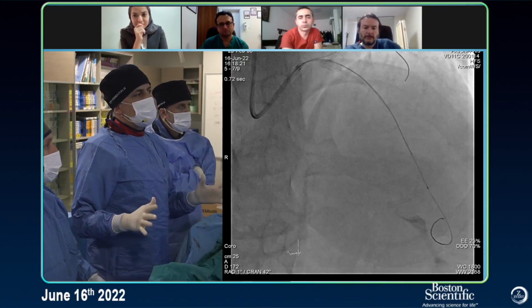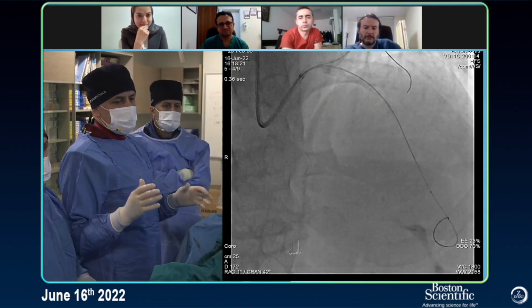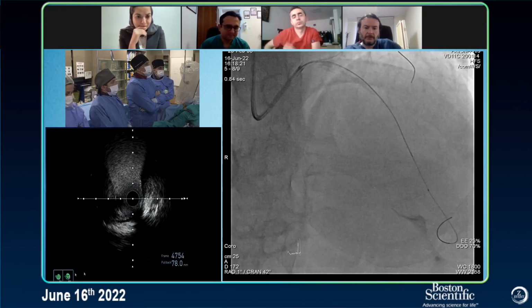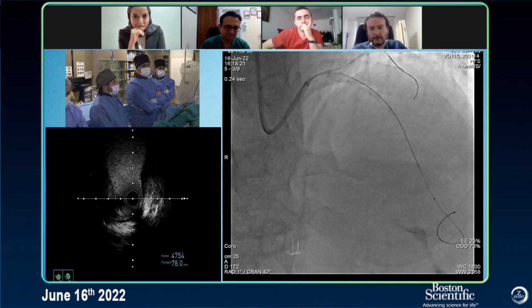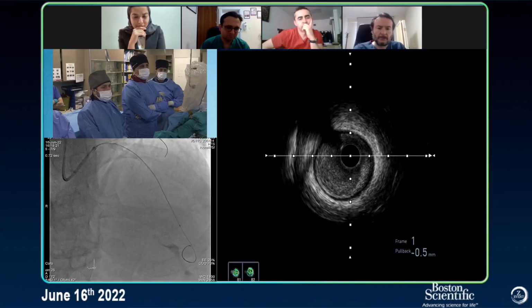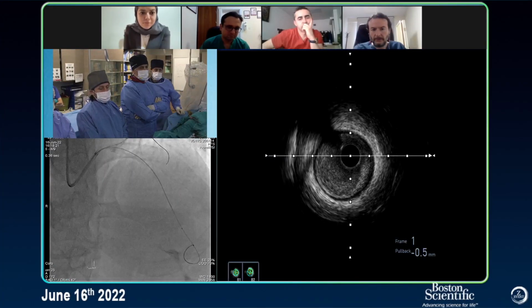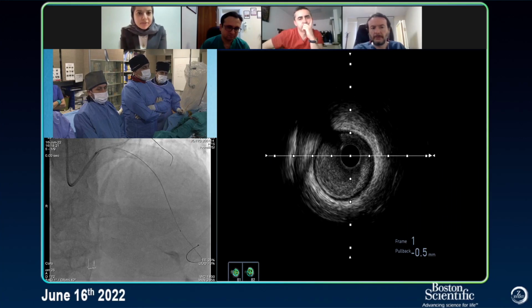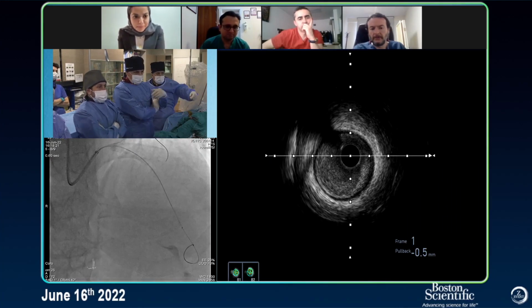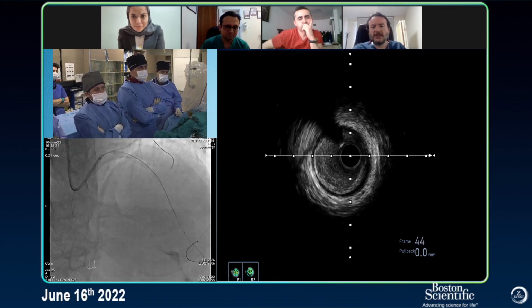Okay. Then we did IVUS before. Let me connect you to show you the IVUS. And let's see the IVUS first, and then you can discuss. Make the IVUS image bigger, please. Did you have trouble advancing the cath? No, it was straightforward. Yes, play, please.